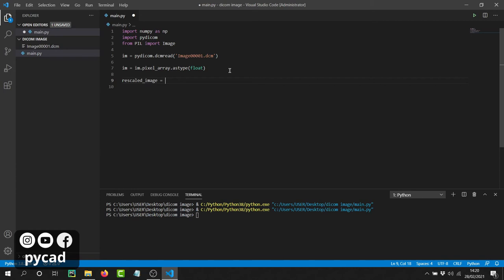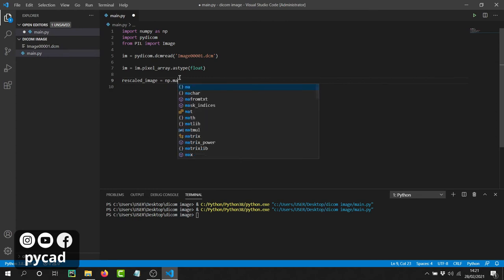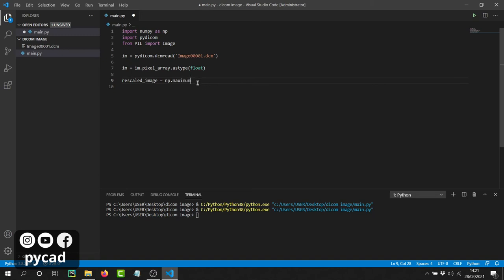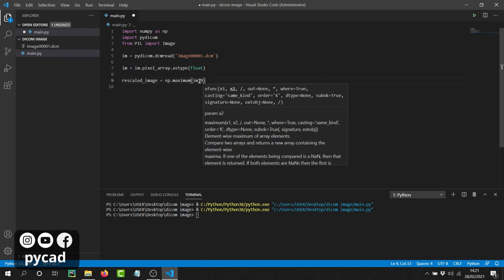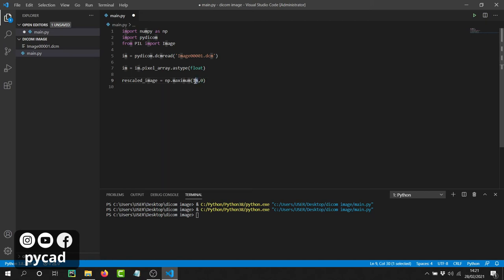Now we'll use numpy to do the rescaling, because this image is an array and numpy makes it easy to manipulate arrays. I'll store the result in a variable called `rescaled_image`. We'll use `np.maximum(image, 0)` — this is because we want to keep only pixels that are between 0 and 255. For any negative pixel values, this function converts them to zero.